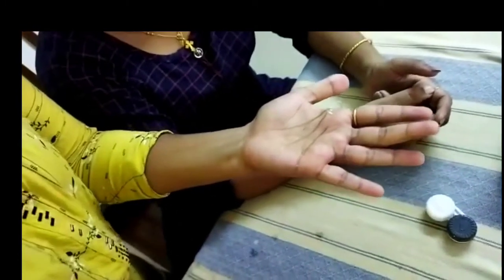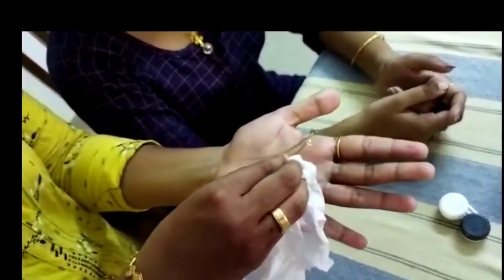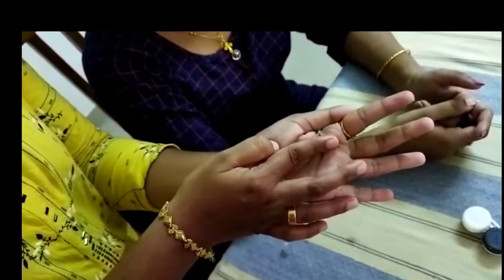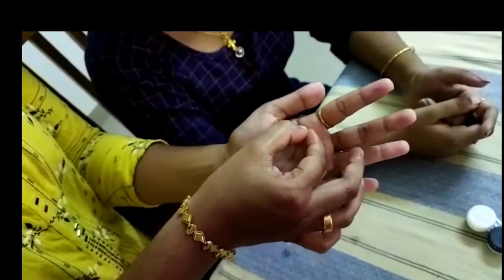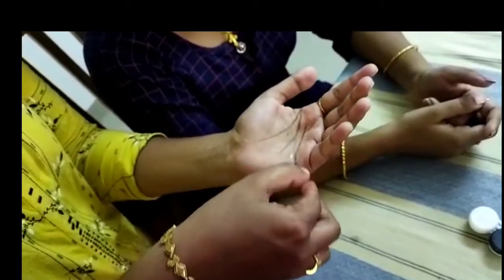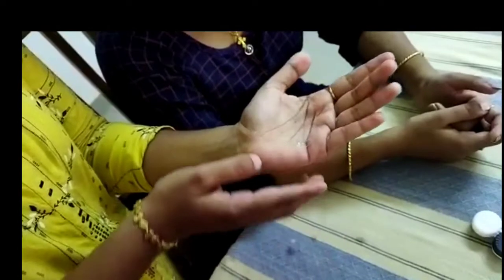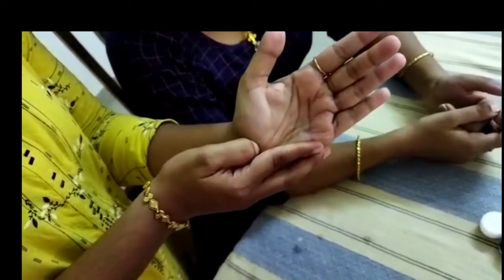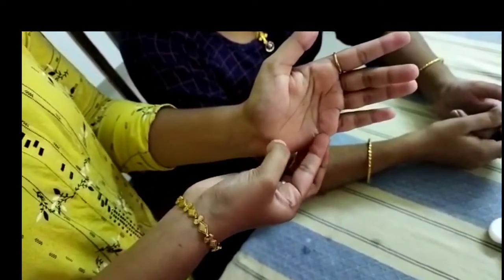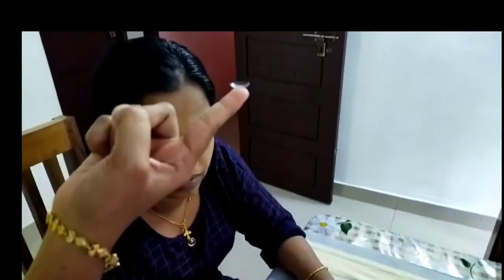Before we start, make sure to dry our hands prior to handling the lenses. Then look at the edges of the lens. If the lens is in the correct position, it has an even cup shape. If the lens is in the incorrect position, it is shallower and points at the edges. Inspect the lens to ensure it is oriented correctly — a perfect cup shape means it is ready for insertion.